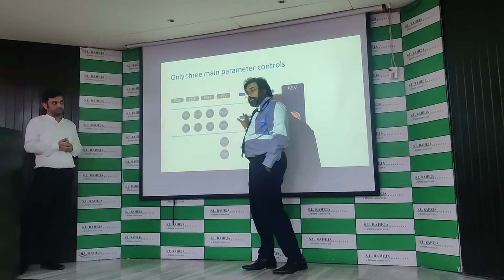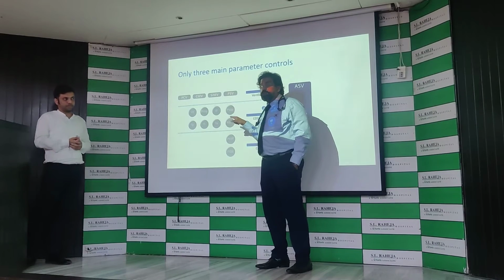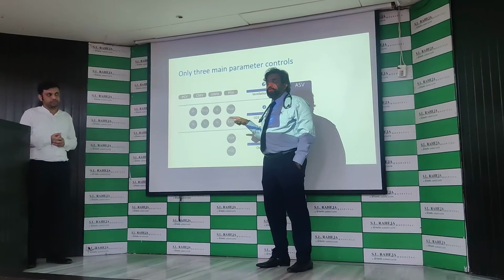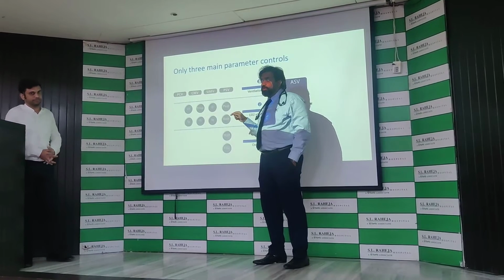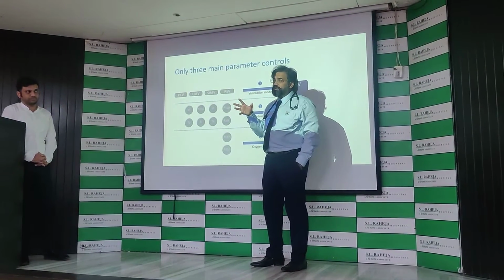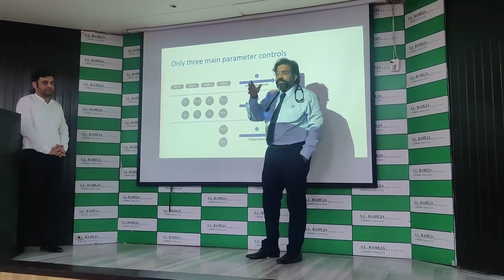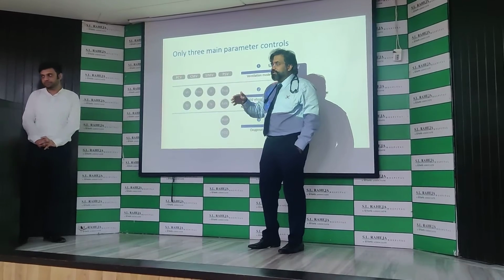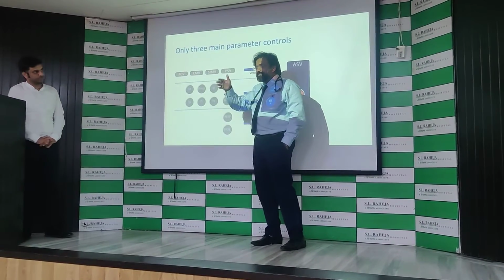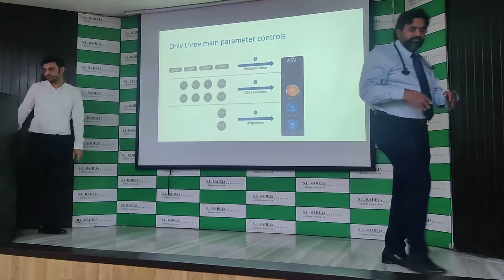Here, this is done on a continuous basis. So you don't have to keep setting it. If you are not setting your ventilator and not touching it again and again throughout your duty, you are not doing anything. It cannot be that your patient is a box. It's a lung. It's not going to remain the same. As you are treating, this patient is going to change. As the patient changes, your settings have to change. If it remains the same and you are not touching it, you are not doing anything. You understand? Okay.